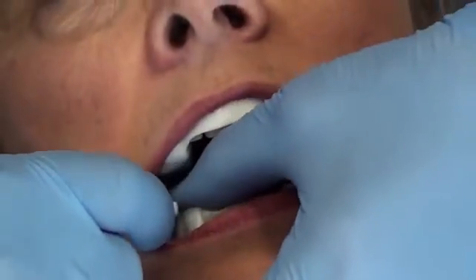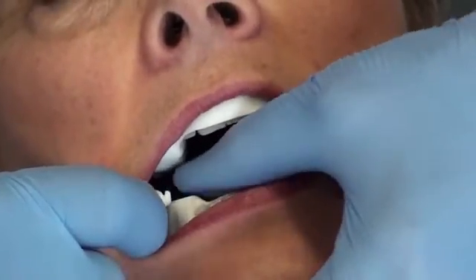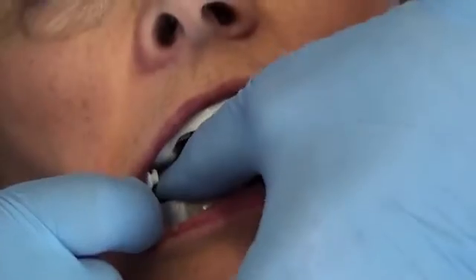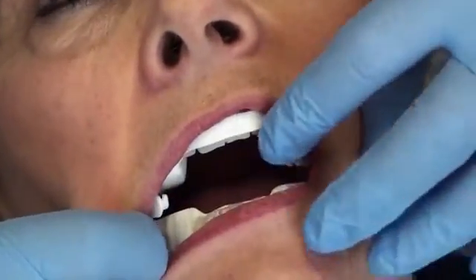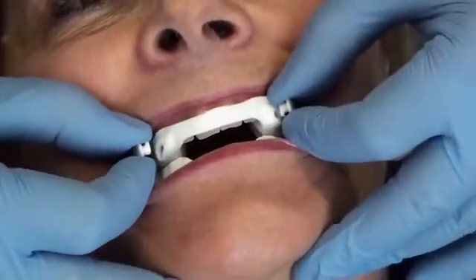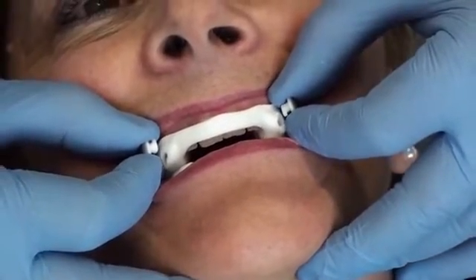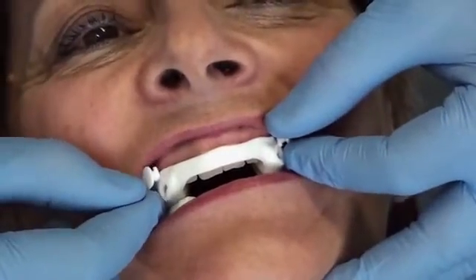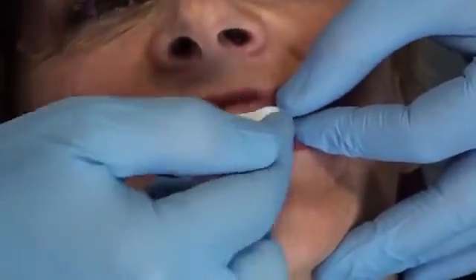You know it is well positioned when you hear a clicking sound, when the appliance is well set, or when you are not able to push it further. We ask the person to close their teeth together and to bite hard to properly put the device into place. We must check the occlusion, i.e. whether the left and the right sides make contact at the same time.